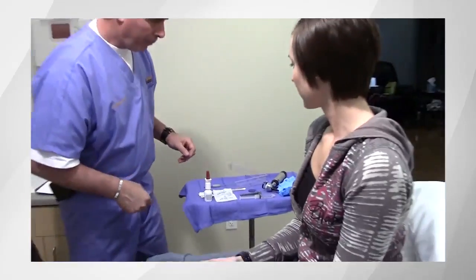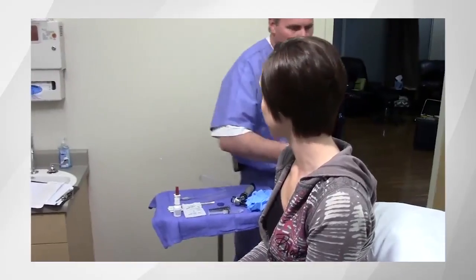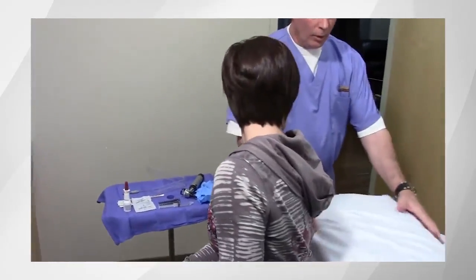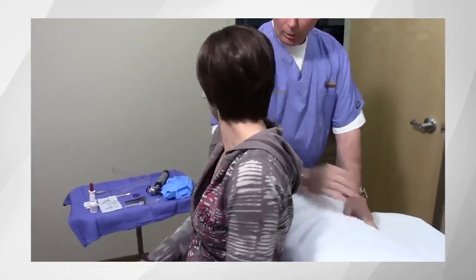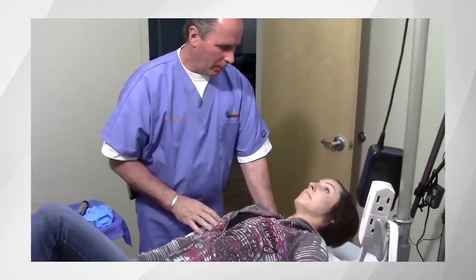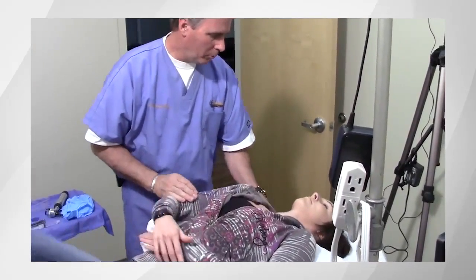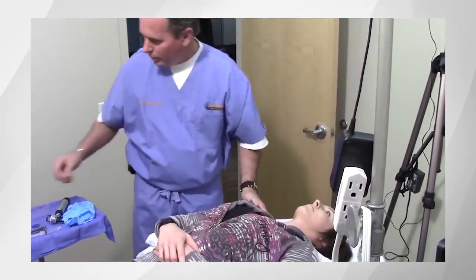The procedure is done with the patient lying flat on their back so that the medication can easily be delivered to the appropriate location. Placing a pillow under the shoulders and resting the patient's head on the procedural table will extend the neck, creating an easier point of access for the practitioner and maximizing anesthetic delivery to the superior posterior nasal cavity.